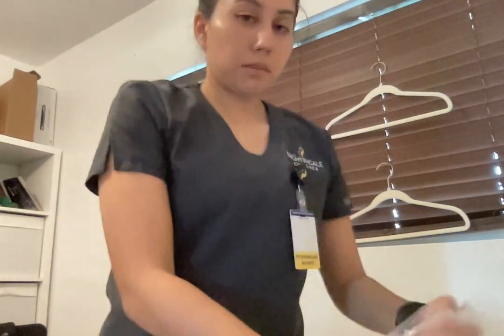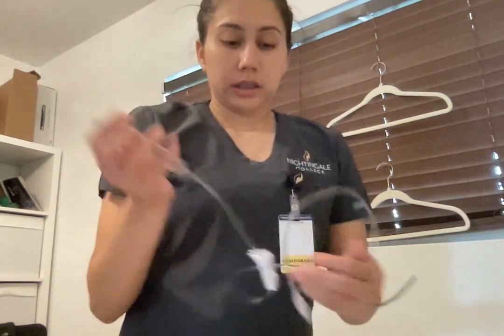And then from here, this Y adapter allows other tubings to get into there, like for example medications, so it could go into the same line. And this adapter right here goes into the patient's IV. My secondary line, same thing: spike, chamber, clamp all the way down, and the adapter, but this adapter will go into the Y tubing.